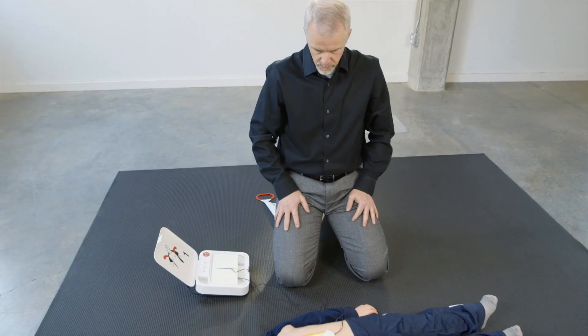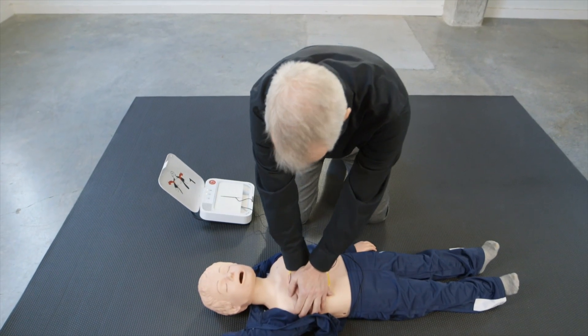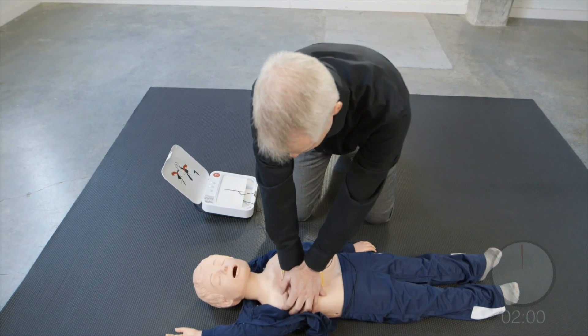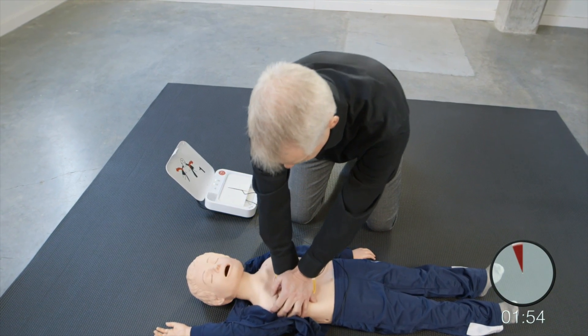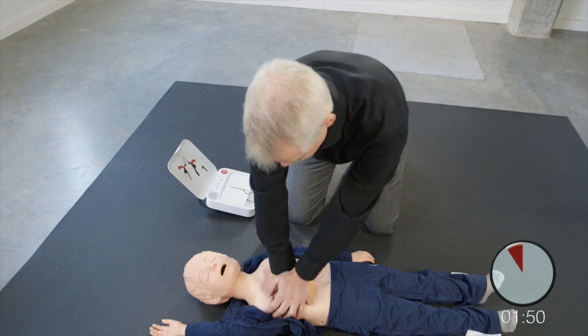Shock delivered. Provide chest compressions to the beat. The heel of one hand should be in center of chest. The other hand should be on top of first hand. Push down deep. Provide two breaths.